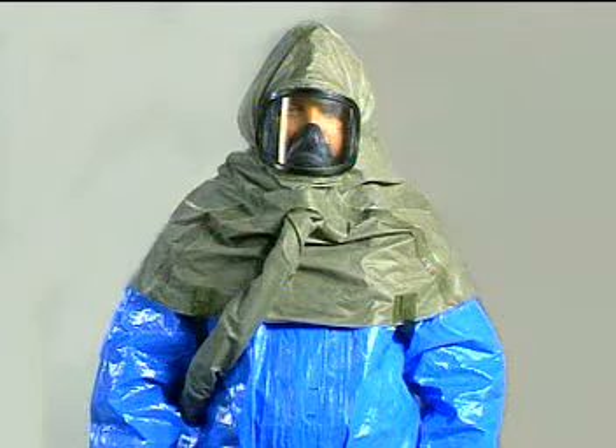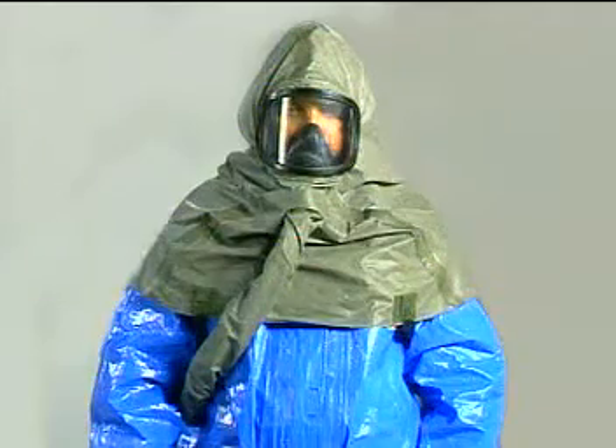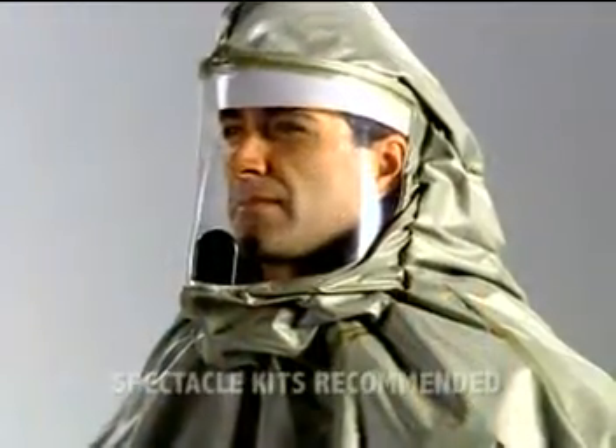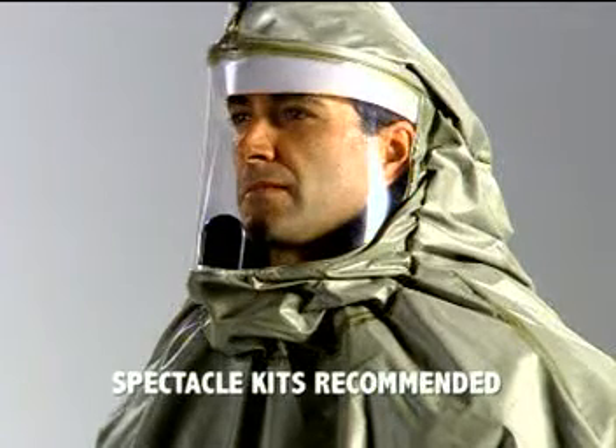The tight-fitting PAPR cannot be used with eyeglasses or facial hair because they can compromise the integrity of the seal around the facepiece. The loose-fitting PAPR accommodates both and does not require a fit test like the tight-fitting PAPR.